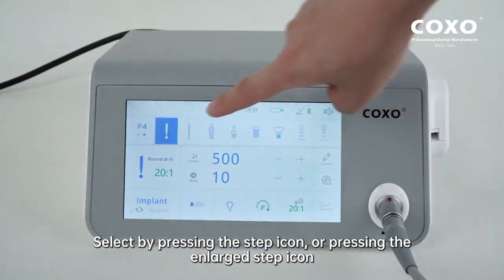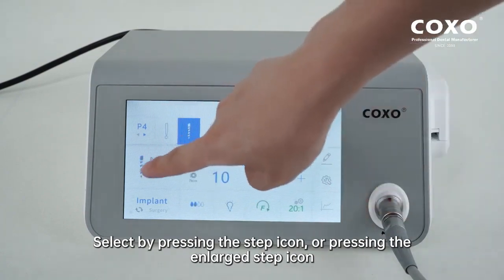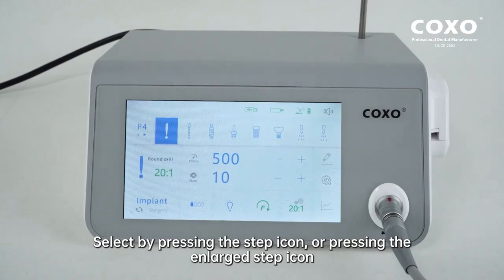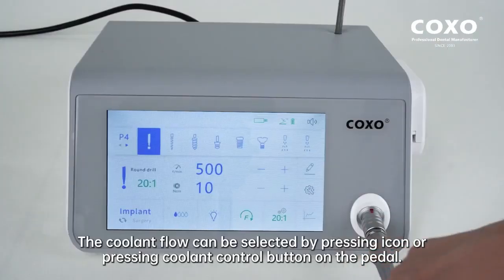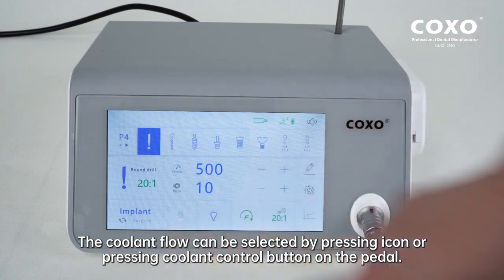Select by pressing the step icon or pressing the enlarged step icon. You can also select by pressing the program control button P of the pedal. The coolant flow can be selected by pressing the icon or pressing the coolant control button on the pedal.